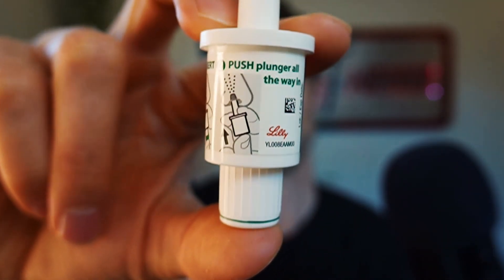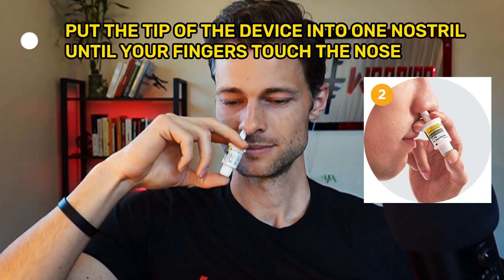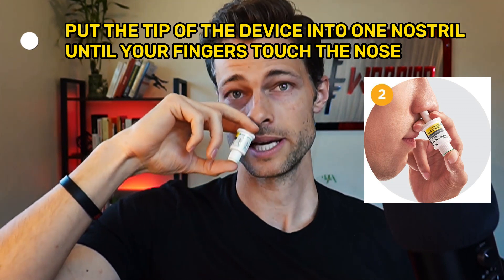Push the plunger all the way in until the green line disappears — meaning the green line goes up inside the housing. Hold it with thumb and two fingers. I'm going to be real careful not to push it because my blood sugars are perfect right now — I'm at 120. I do not want to see them go to 500. Gently insert into one nostril until fingers touch the outside of the nose — so it's about halfway up your nostril.